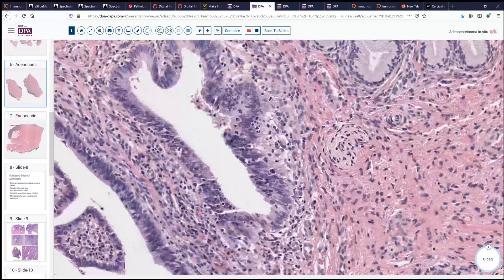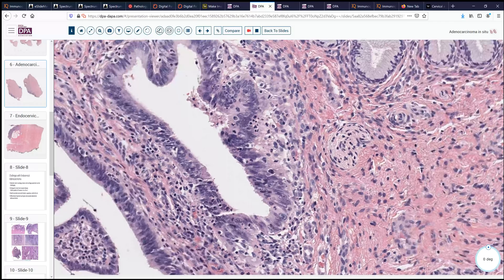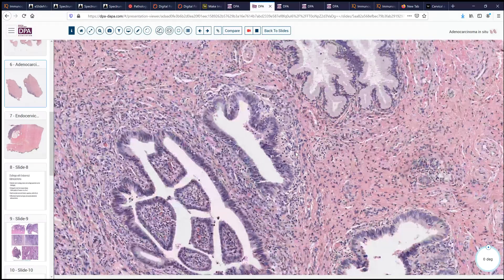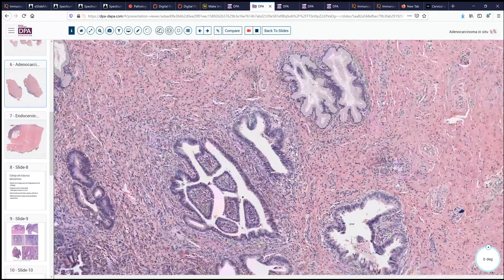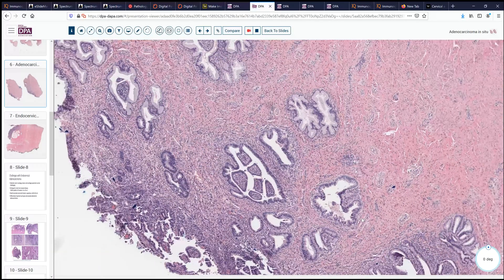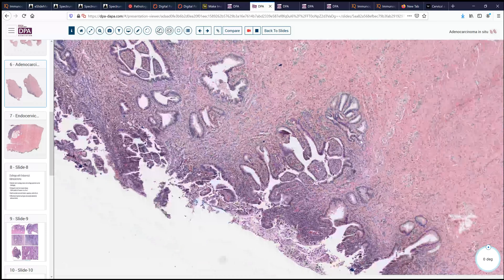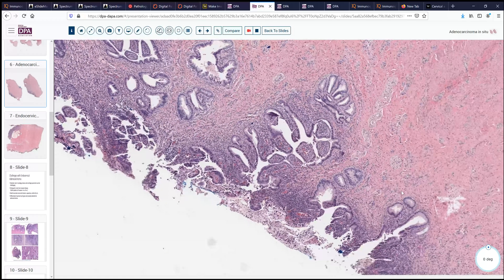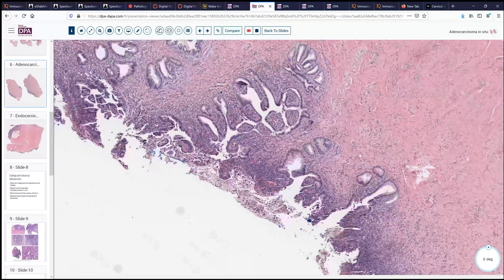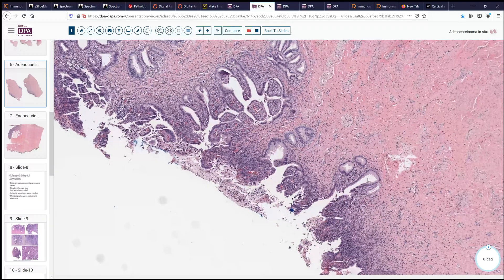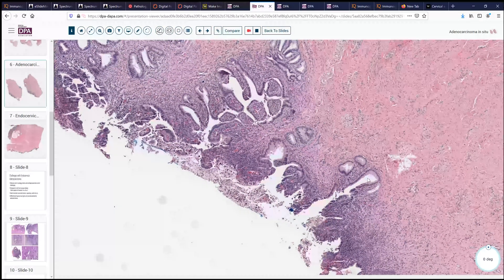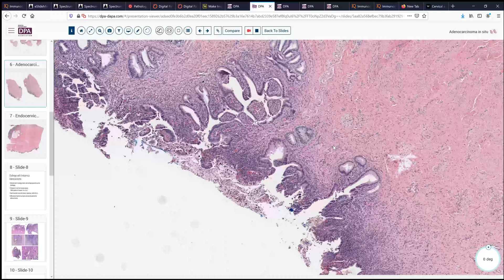Is there invasion here? We don't really see any definite invasion around these glands. Invasion can be a tricky and challenging entity to discern in endocervical carcinomas.